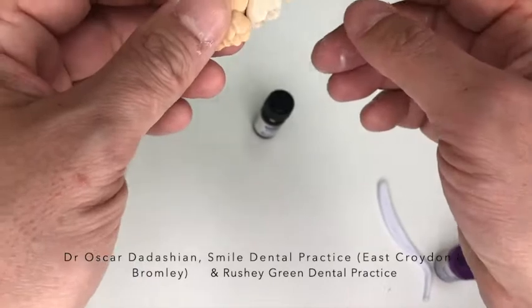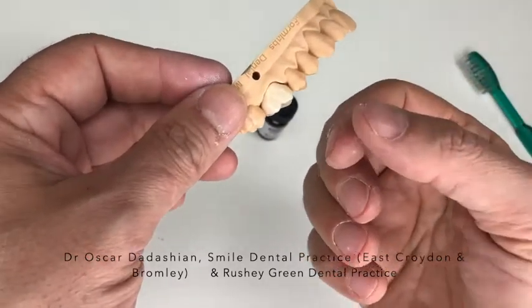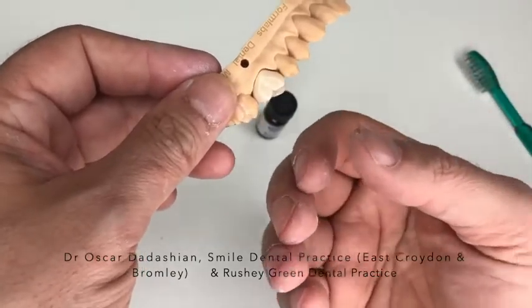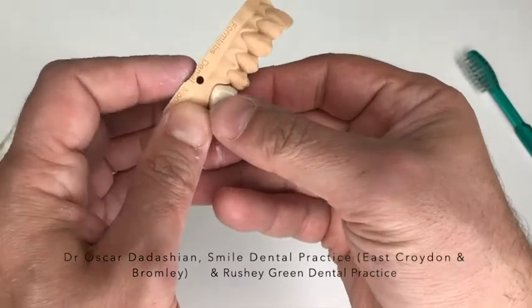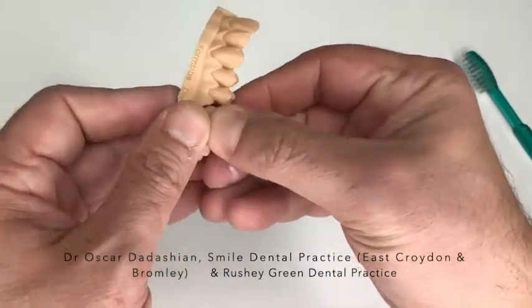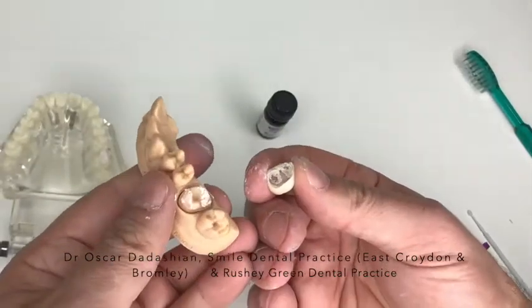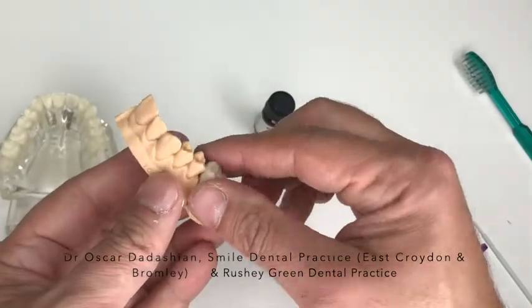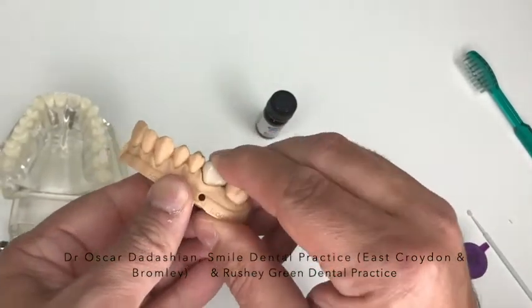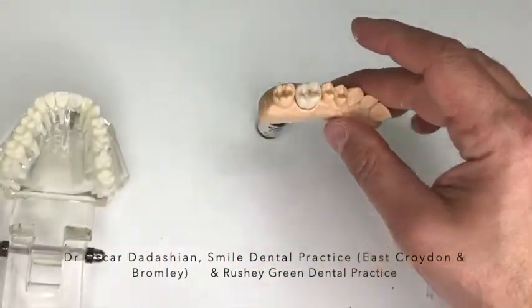But what if that happens? What if you put it in, you bite together, and it's very hard, it's too high, you can't push it any further in? It's going to take a while for this to set, 2 to 3 hours. So you feel free to remove the crown. Again, brush everything, brush this clean, remove some more of that material, and then pop it back in again and try it. Again, just bite together and make sure it's all in.